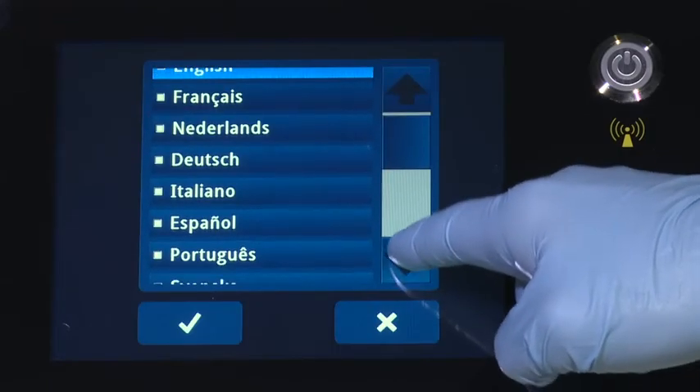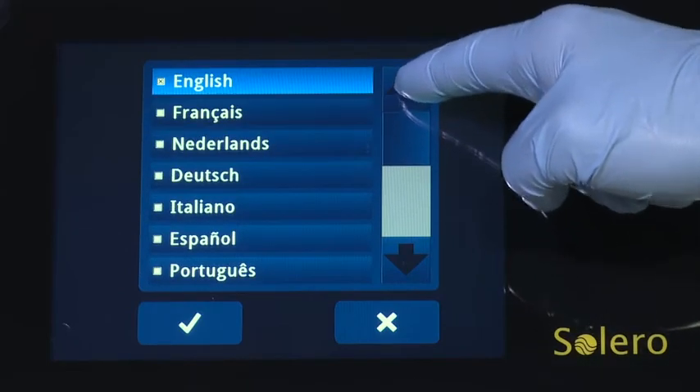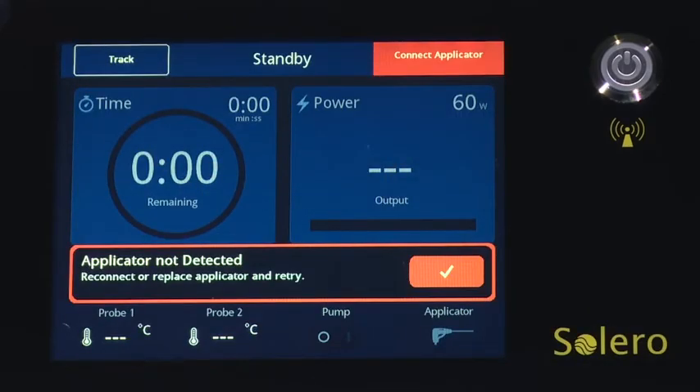Using the scroll bar, you can select the desired language by pressing the checkbox on the left. English is the default language. The Solero system will automatically enter standby mode after initialization and language selection.